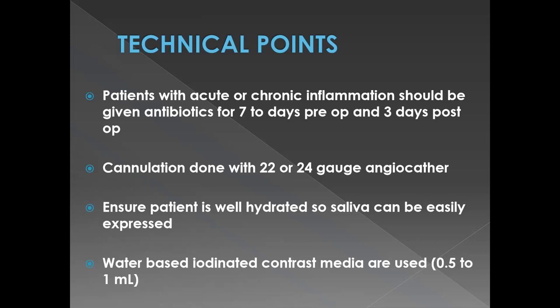So if you inject contrast into an already inflamed gland, the patient will very quickly tell you that now my gland is hurting, don't give me any more contrast. So the study will not yield any useful information, because you can't give the full amount of contrast that you're supposed to give. So that patient should be given a course of antibiotics for 7 days pre-op, and then continue it for 3 days post-operatively.